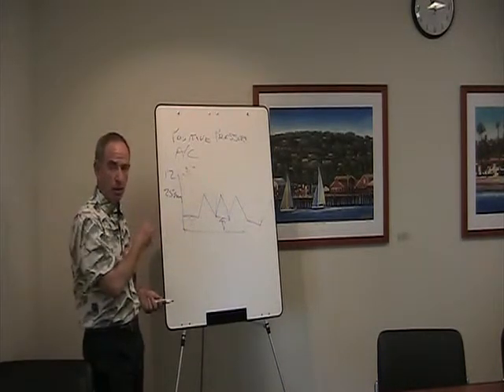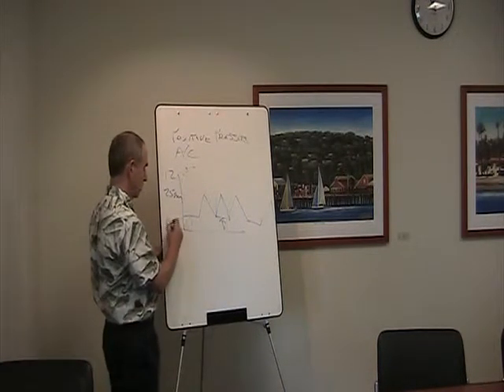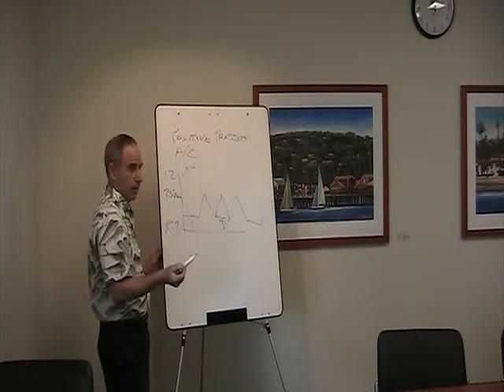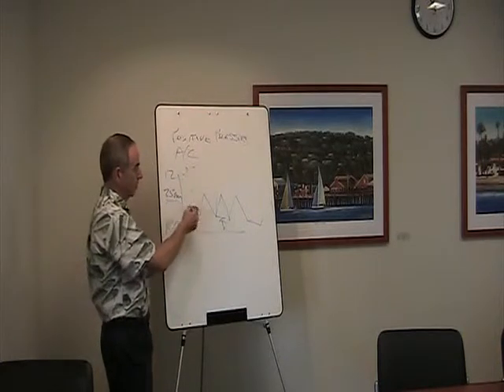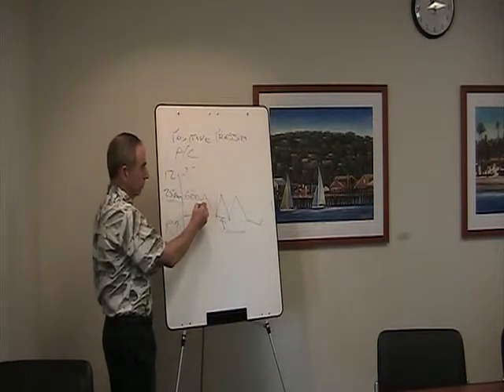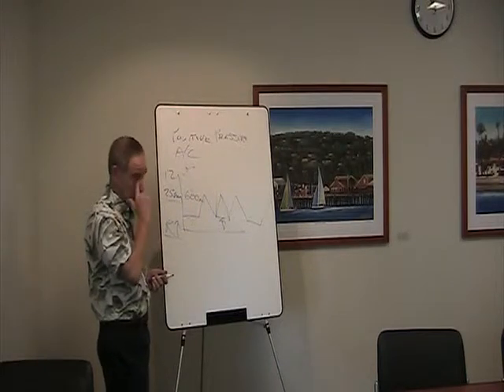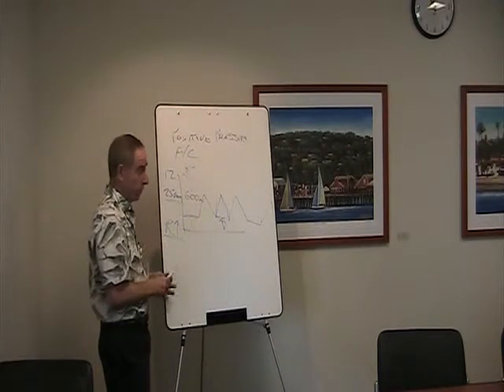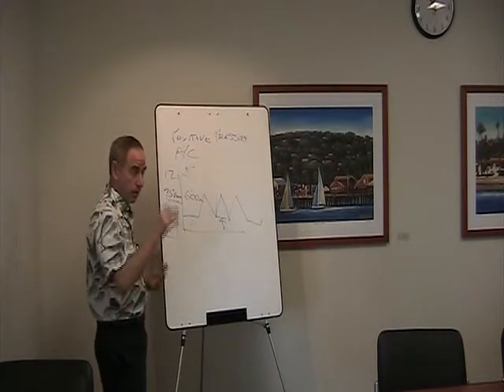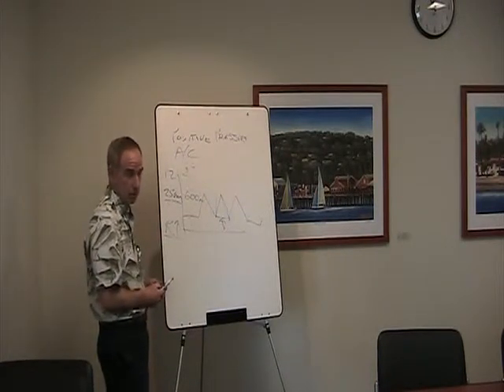So keep that in mind. So in a pressure mode of ventilation, any change in resistance, if the airway's resistance goes up, what's going to happen? And I have it set at 25 centimeters. Say initially it's producing a volume of 600 milliliters. And then all of a sudden the airway's resistance goes up. What's going to happen to the volume? It's going to drop, right? Because now you have an increased resistance. You have the same amount of pressure pushing in, so the volume has to go down. You're not going to get as much air into that patient because this increased resistance is going to prevent that.